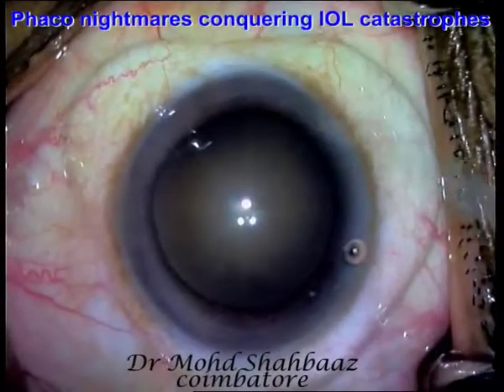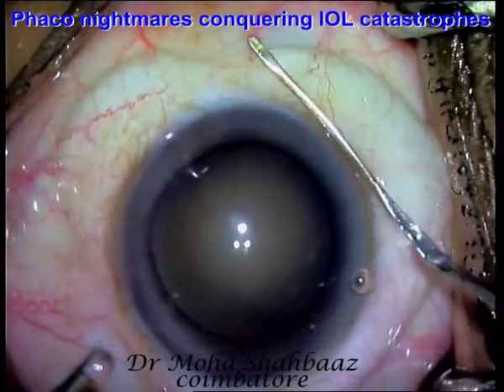Dr. Mohammad Shabaz is a master in Phacoemulsification from Coimbatore. In this video, he demonstrates a Phaco nightmare: conquering IOL catastrophe. This case is a nightmare for any phaco surgeon.